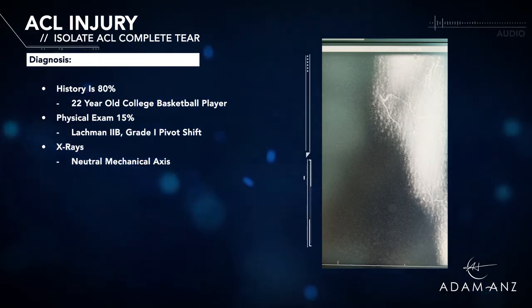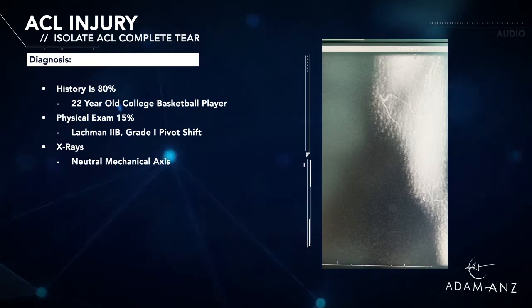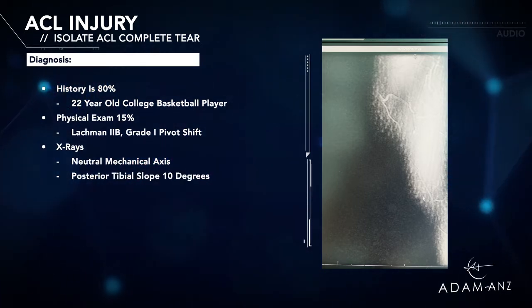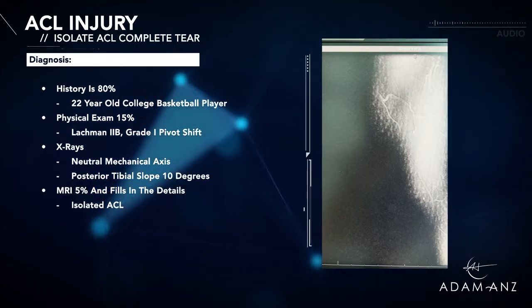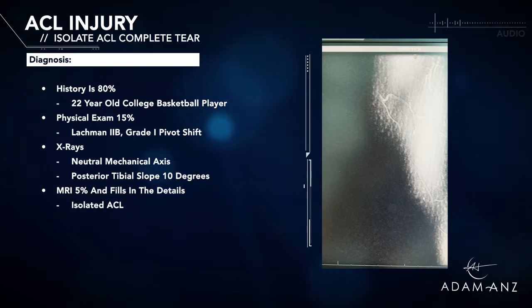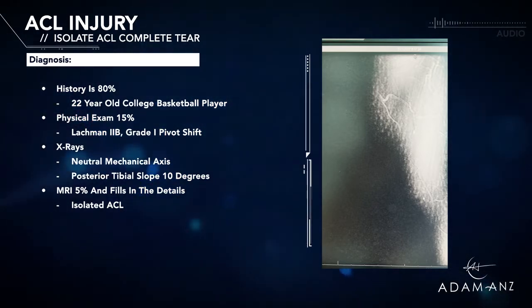X-rays help us think about risk factors for ACL injury. This patient had a neutral mechanical axis and a posterior tibial slope of 10 degrees. And MRIs fill in the details and confirm the diagnosis. This MRI revealed a bone bruise pattern, an isolated ACL tear, and intact meniscus tissues.